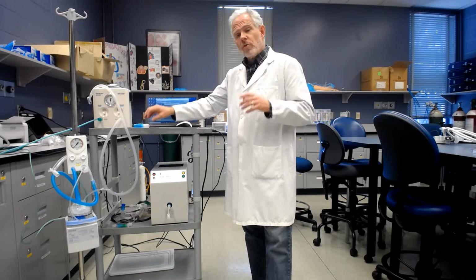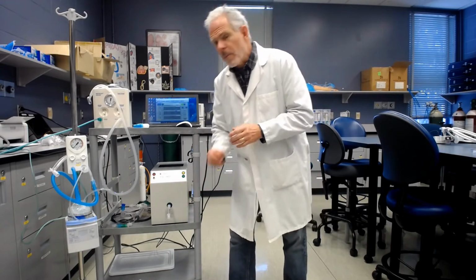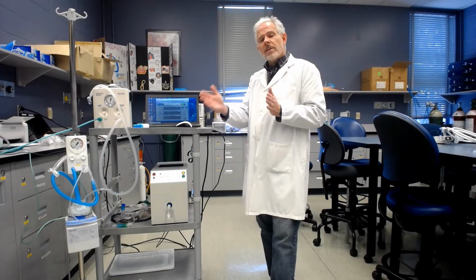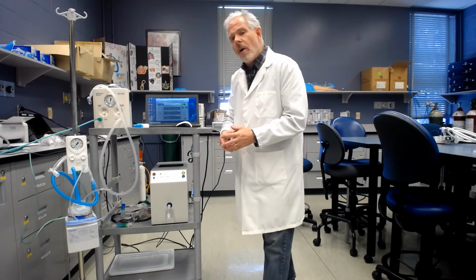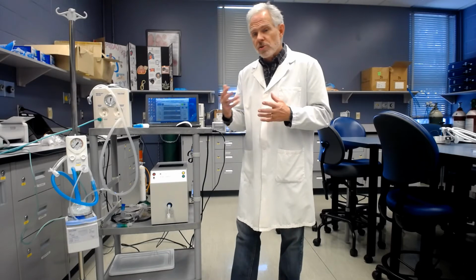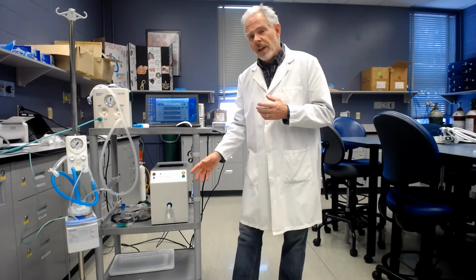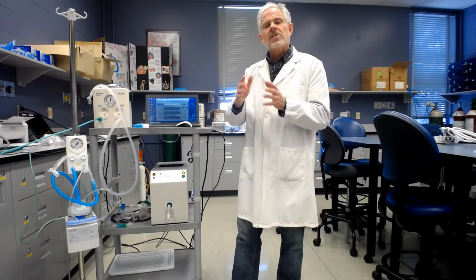All right. Now, to impose a bit of work of breathing on the system, I've got a 3.0 endotracheal tube. So the pressures measured by the ASL during spontaneous breathing and with positive pressure breathing are going to have an artificially high resistance imposed upon them through this 3.0 endotracheal tube, which could sometimes be used during resuscitations. I'm going to differentiate between the resistance caused by the endotracheal tube and that imposed by the devices so that we can see differences in performance.